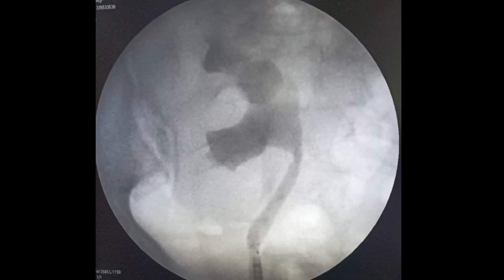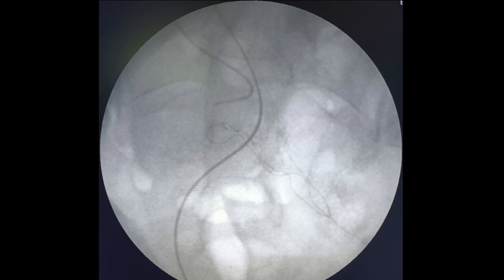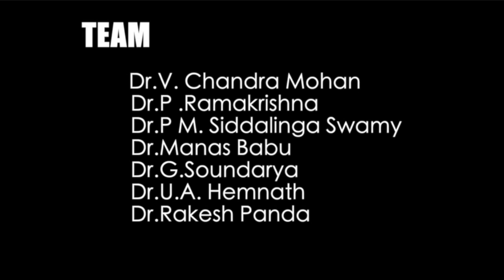The total laser time used was 23 minutes and the total duration of surgery was 55 minutes. Having a flexible ureteroscope with good deflectability, a well-trained assistant team, the ability to basket the stone, and the thulium fiber laser were the factors which contributed to successfully completing the case. The patient did well postoperatively. Thank you.